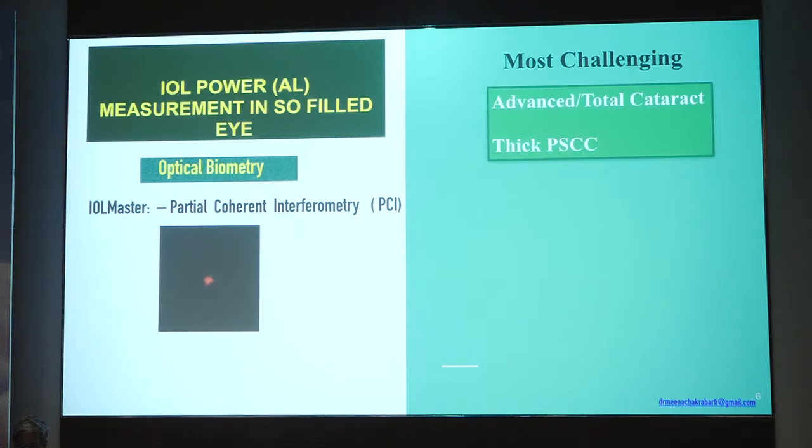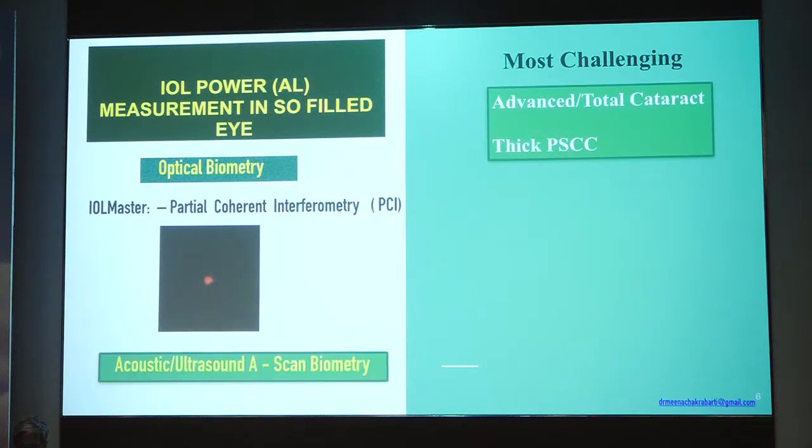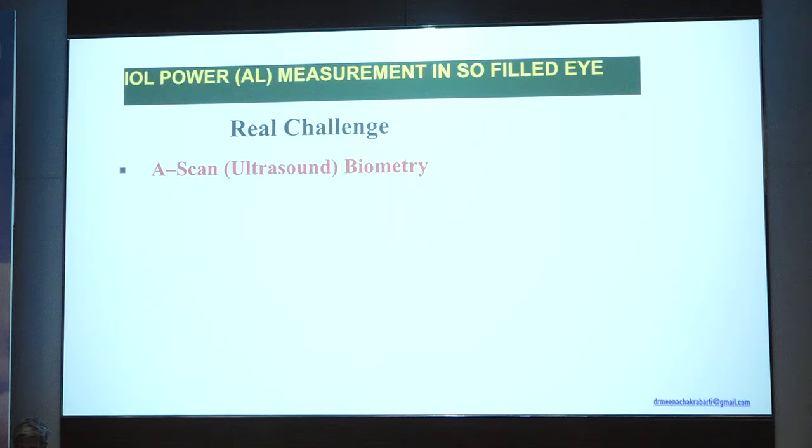And you can always measure the axial length. The ideal would be, like what Dr. Kumar said, to invest in an optical biometer, since it gives you a definite idea of a definite axial length measured from the surface of the cornea to the retinal pigment epithelium. But if you do not have an optical biometer and have to use an ultrasound biometer, then there are real challenges, and I'll give you a few tips on how to get around the situation, although it is not the ideal situation.